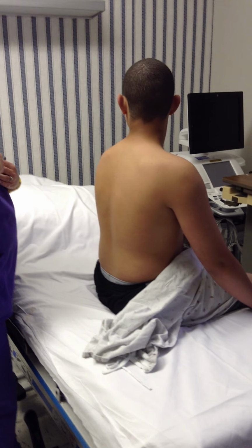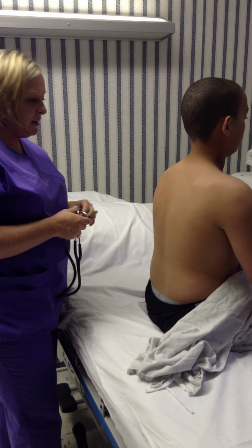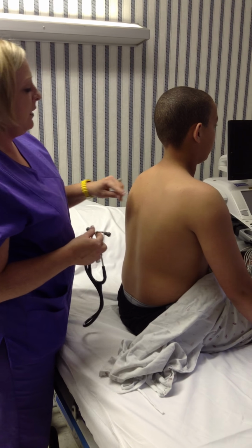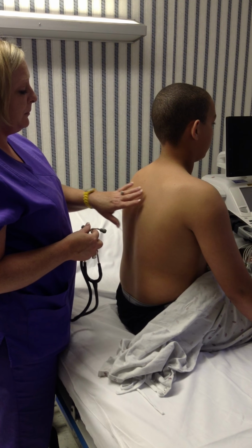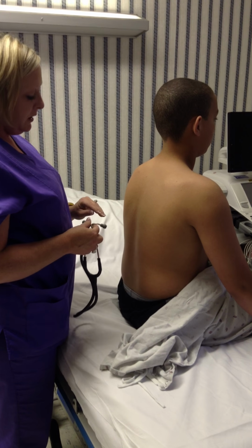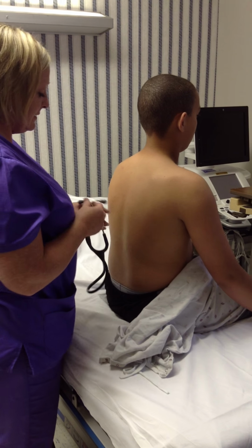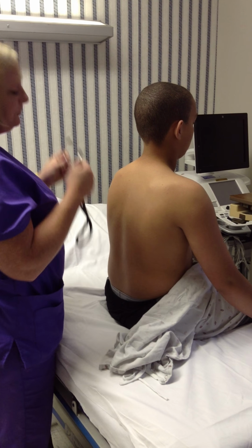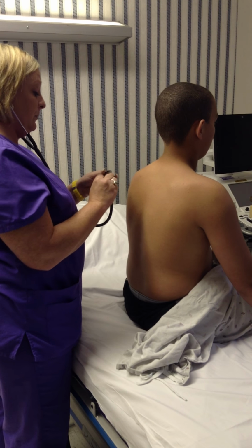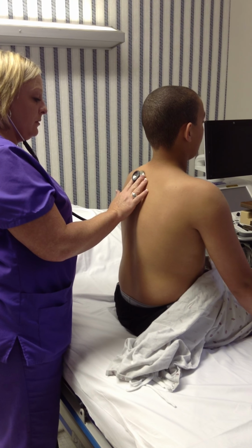Micah, what I'm going to do now is I am just going to listen to your lung sounds. And once again, the bronchial lung sounds are found in the nape of the neck. And then I'm going to move down to the bronchovesicular, which are located in between the scapula. And then we're going to do the vesicular lung sounds, which are over here. And you use the diaphragm of your stethoscope. Go ahead and take a deep breath.